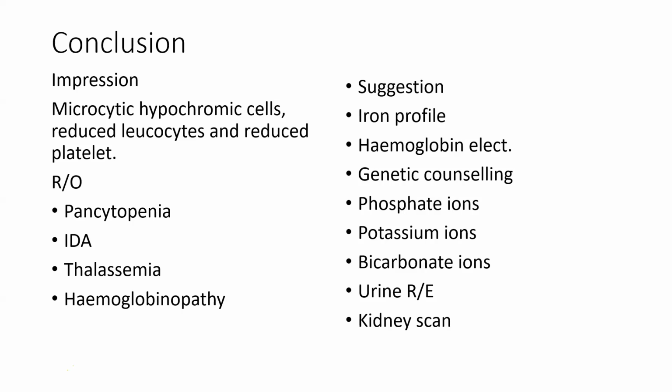Now, I want to put it into a big perspective. If you run an FBC and your neutrophils are a bit increased, but not beyond the upper limit, perhaps there are times that pregnant women have these cases. So you have neutrophilia in pregnancy, yes, it's understandable. Then you're able to attribute it to a physiological condition. There are times in acute infections that the lymphocyte is slightly increased, but it might even be more than the neutrophil.